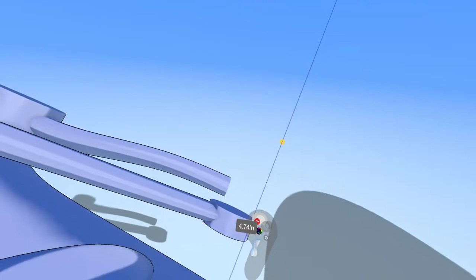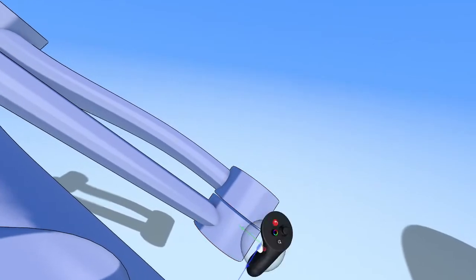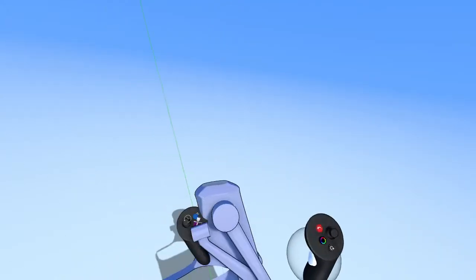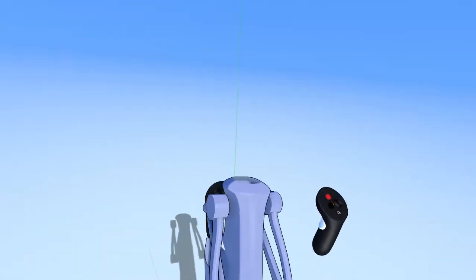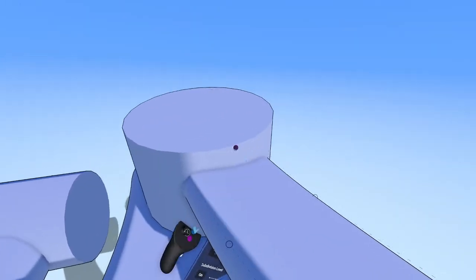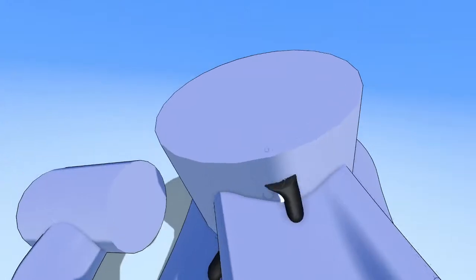So let's just actually make a couple of cylinder shapes like that, bring them together. All right. And if we want, you know, we can come in here and add more edge loops and, yeah, shape this thing.